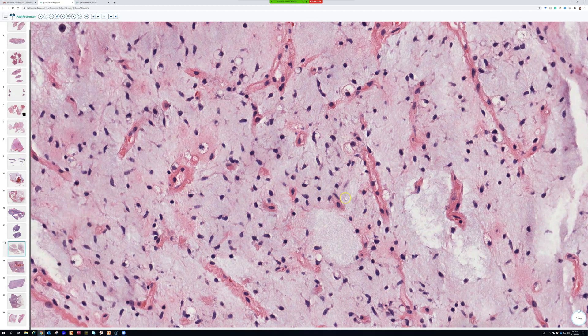The cells are also very bland. This is a translocation sarcoma — these cells have a translocation: FUS-DDIT3 (used to be called FUS-CHOP) is the most common one. Occasionally a subset, about five percent or so, will have EWSR1 rearranged with DDIT3 — EWSR1 being the Ewing's gene.